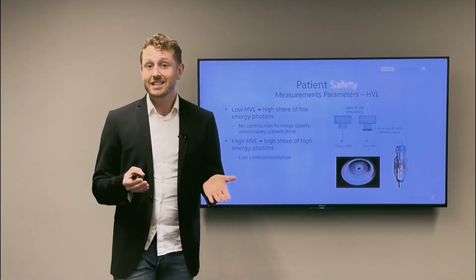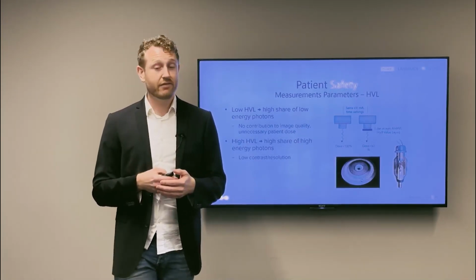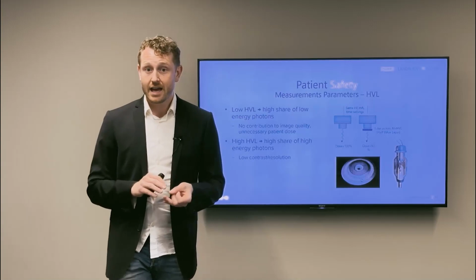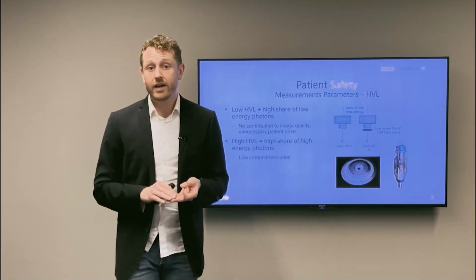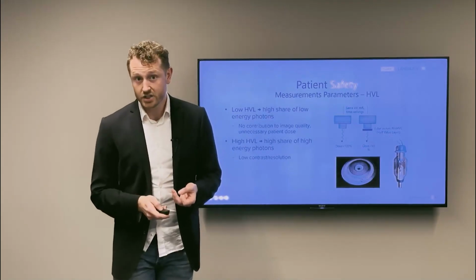All previously discussed hardware defects will affect HVL. Filament and anode vaporization will add to the filtration. Roughening of the anode surface may also change HVL.